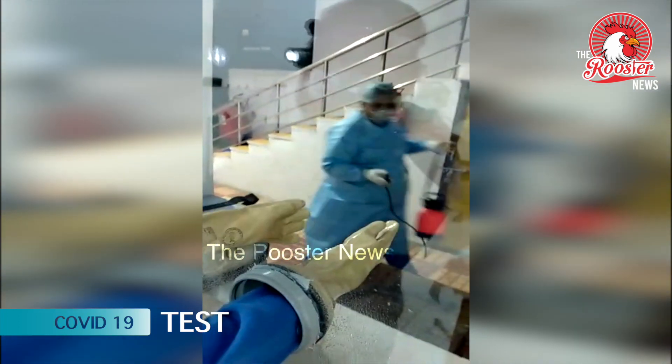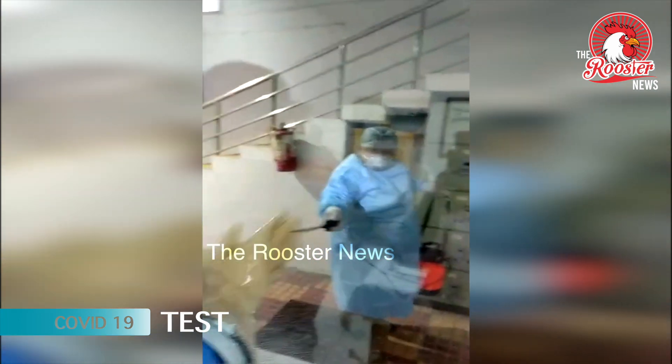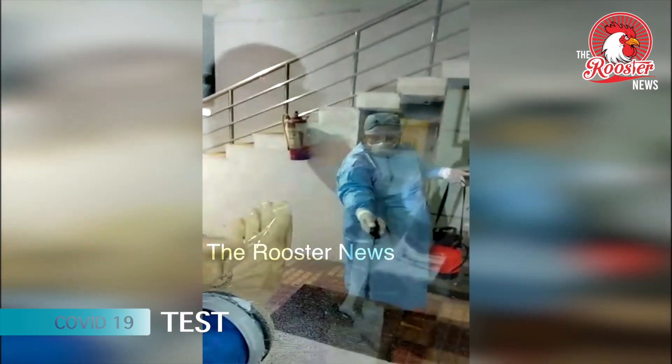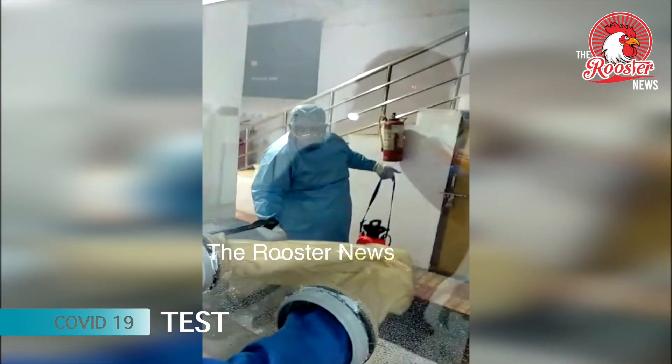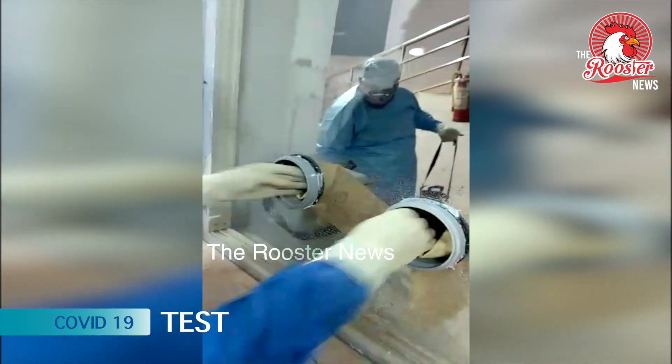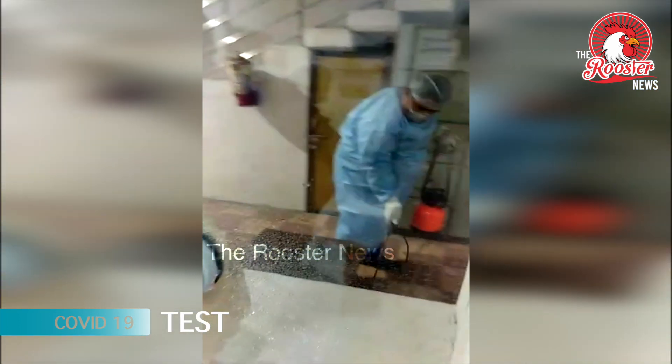The spraying will be done again to the hands. The person is protected with PPE of the operation theater. The hands are removed now. That is the total procedure.